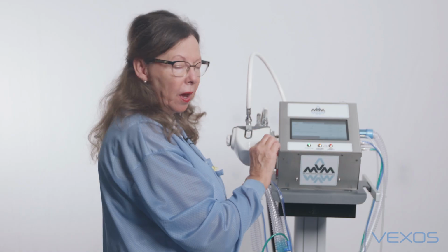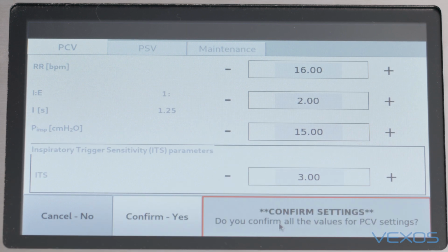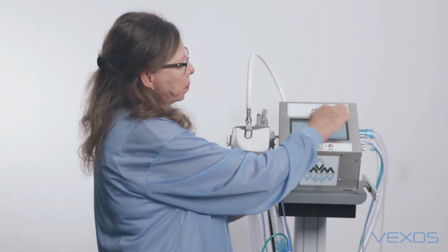All of these have now been set, and I can now apply PCV. That means I'm confirming those settings and confirm yes. That PCV settings has been done.